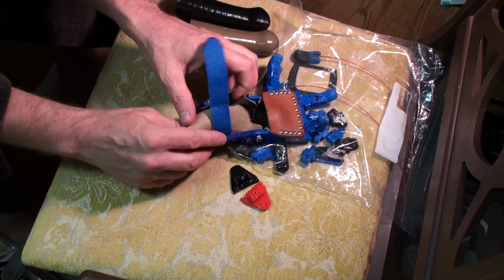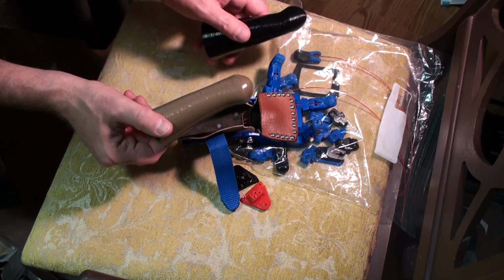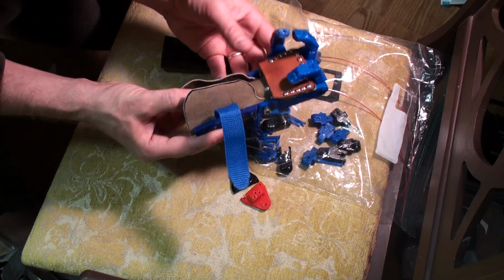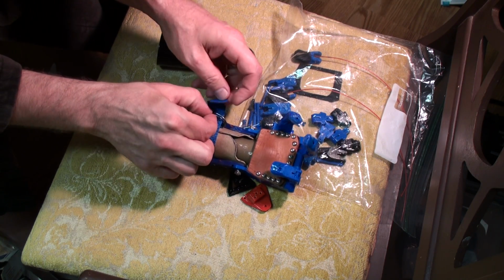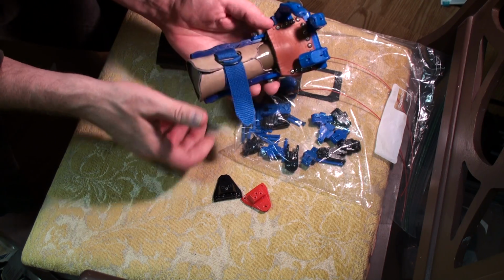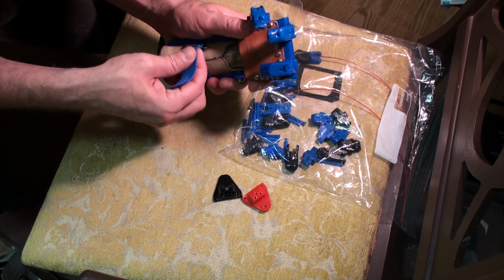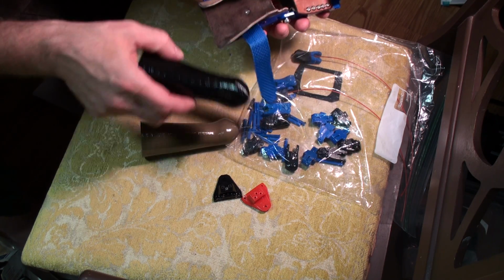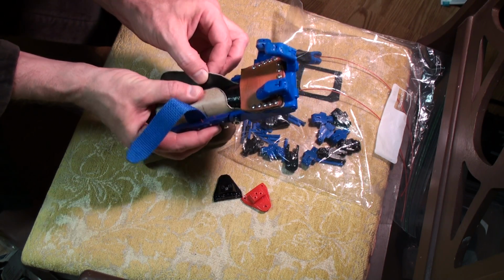I'm actually going to use an armature. I've got two armatures here. This one should be like Ody's hand at the time of the photograph, and this one is scaled up 5% to compensate for growth. And you can see that the smaller one fits in just fine. Again, through both, and then return. And I decided that a single strap is probably a better fit and more adaptive than having two straps. So there you go. That's one, and then the slightly larger one to compensate for growth. Human growth is not uniform, so this is probably not completely accurate, but should be close enough.